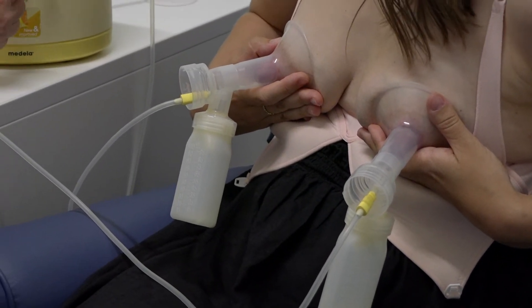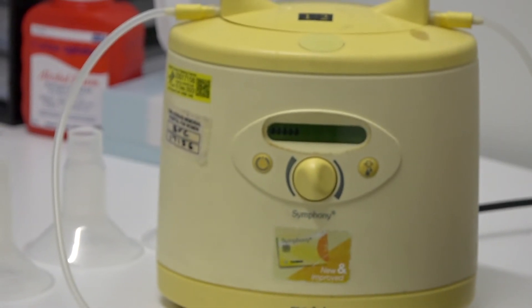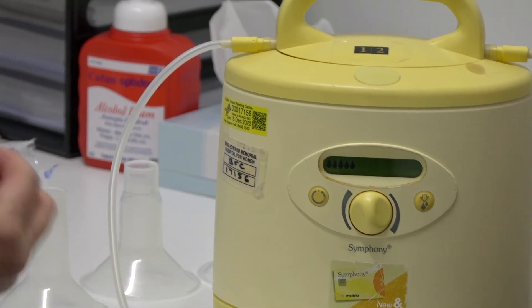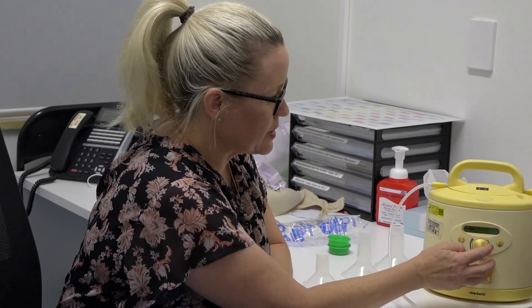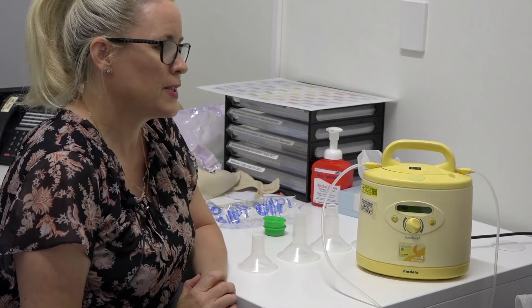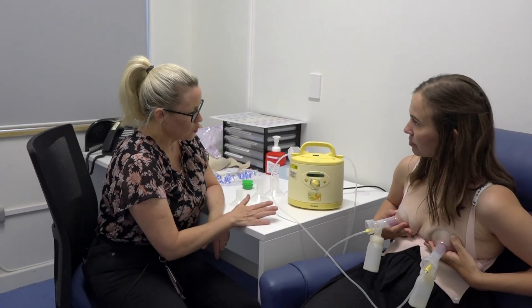If you notice after a while that the milk isn't flowing quite as quickly and freely, press this button again to take it back to the stimulatory action. The reason is we want your breast to have another letdown before switching back to the longer, stronger extraction action. What we're trying to do with the pump is mimic what the baby does when sucking at the breast — when your baby feeds, she would trigger multiple letdowns during the feeding, so that's what we're trying to do with the pump. Once it's flowing better again, use that bypass button to go back to extraction.